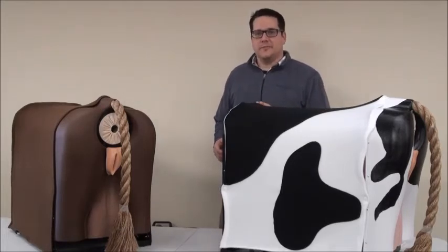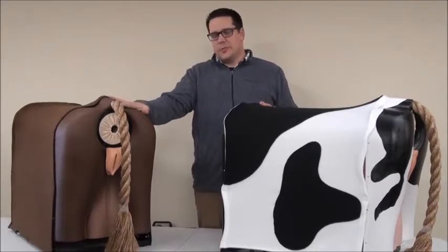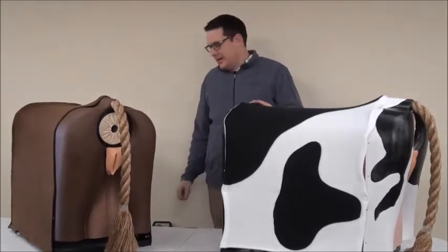Hello, we're excited at RealityWorks to introduce our newest product, the Bovine Breeder Artificial Insemination Simulator. The simulator comes in two different color options — brown or black and white — allowing you to choose what best fits your location and what you want your students to be artificially inseminating.